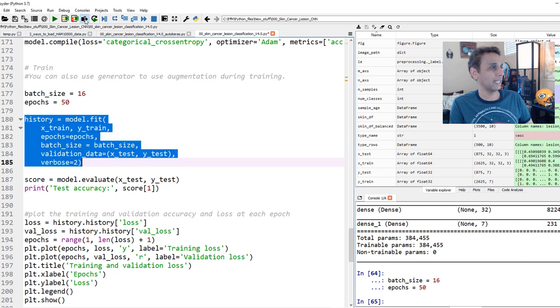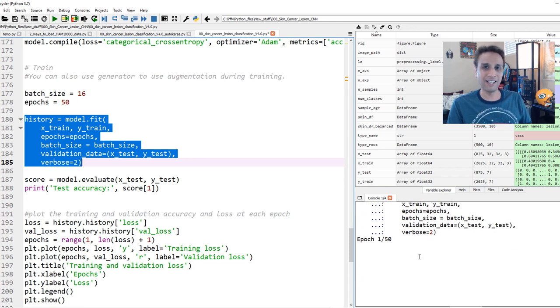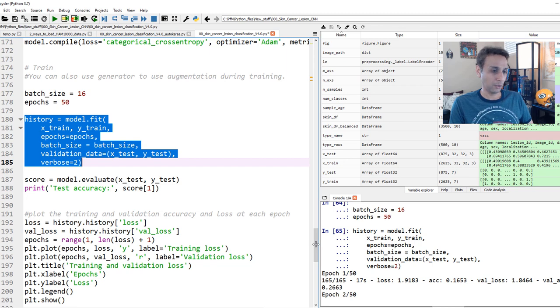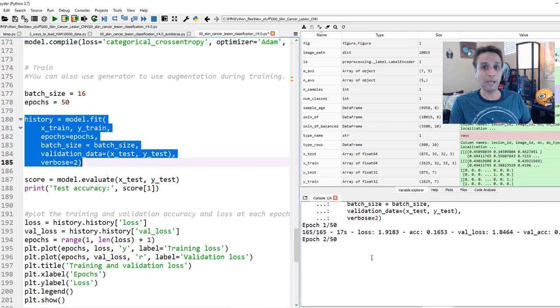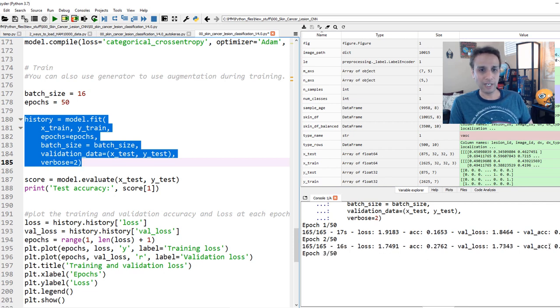This is actually the first time running it during recording — not ideal, but these things take time. Let's look at the first few epochs. The first epoch is done, and now the second. Validation accuracy is heading in the right direction, currently around 28% — not encouraging yet, but let's see where it ends up after 50 epochs. Let me pause the video and continue after training completes.